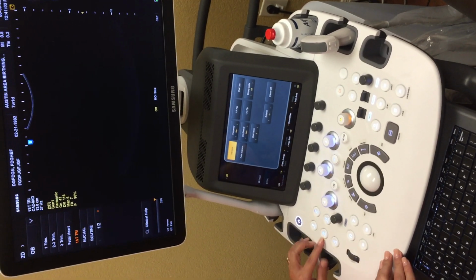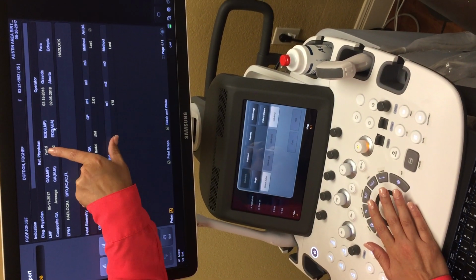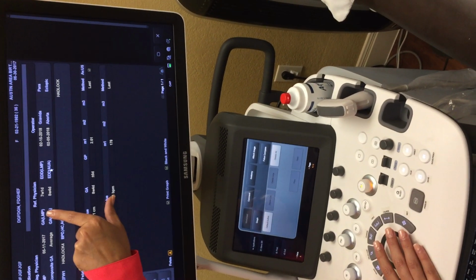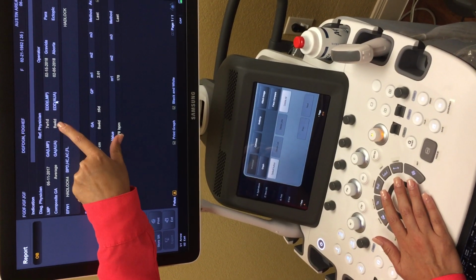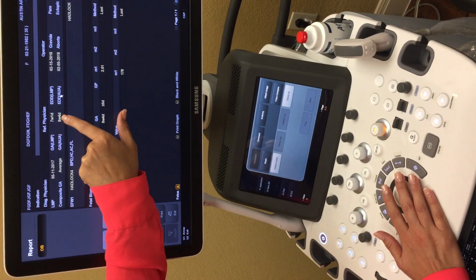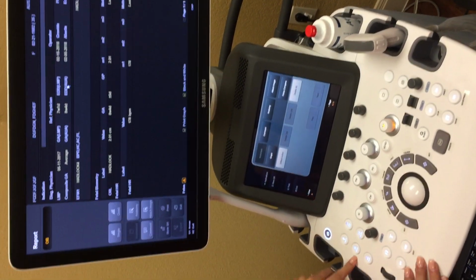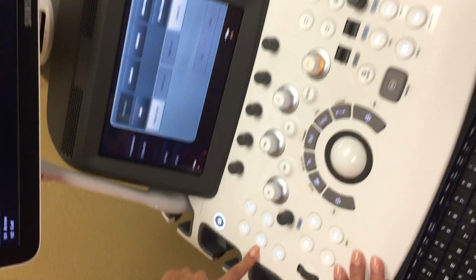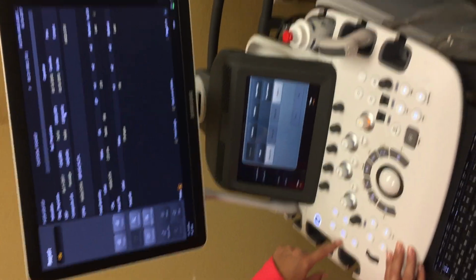And then after that, if you do want to go into report, you can go into report. See, this was the date we put in under patient info, 7 weeks, 1 day. This is actual ultrasound age. That's what that crown rump length measured. And then we have that fetal heart. Where's the report button again? On the right. Yep. Does it say report? It says report. Cool. Love that. It says report.